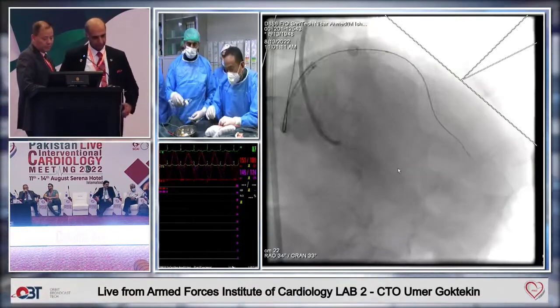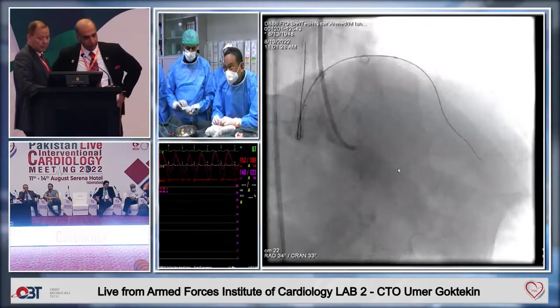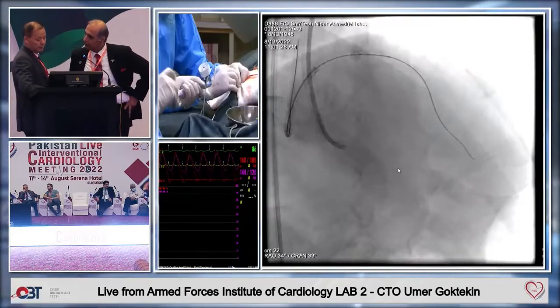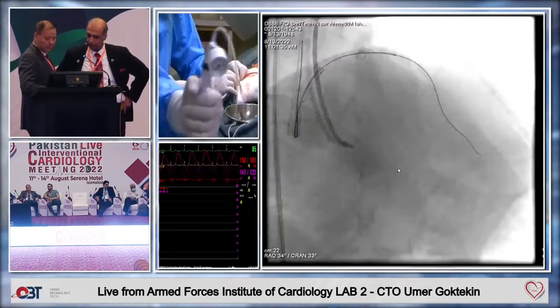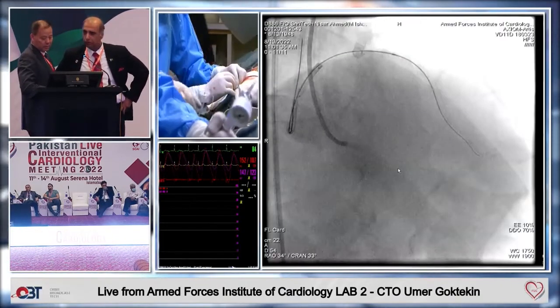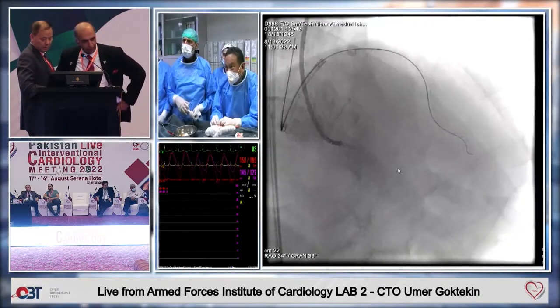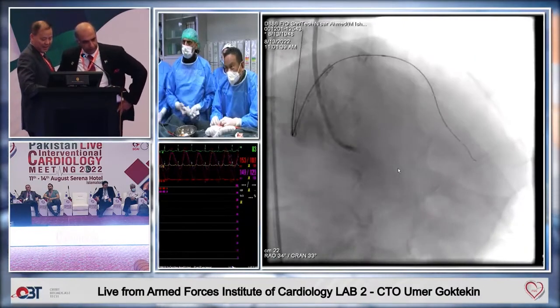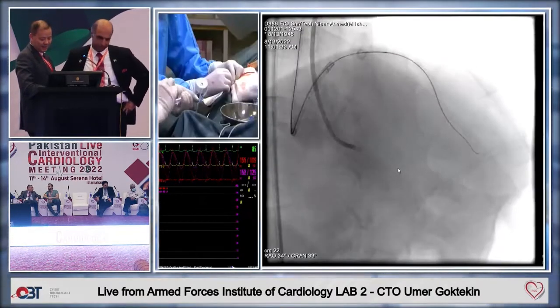Okay, inflate, still some difficulties. Inflate? Yeah. Going up. Four, ten. Yeah, ten. Support. Capture down. So, Rosalie, what was the feeling of the wire when it went through? Was it a pop-in or was it just a smooth run-in? No, it was just soft and it went through and there was no pop-in.